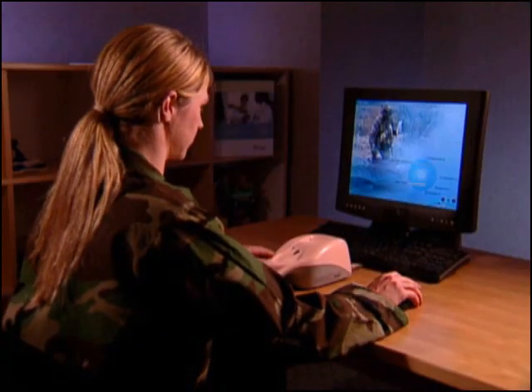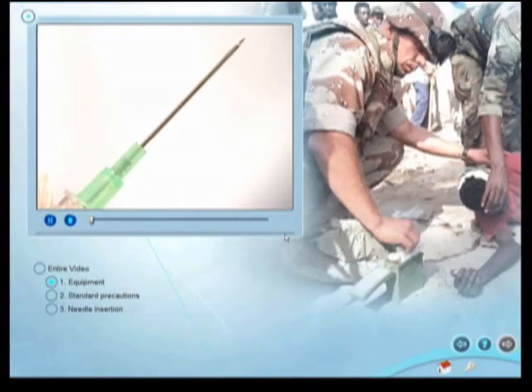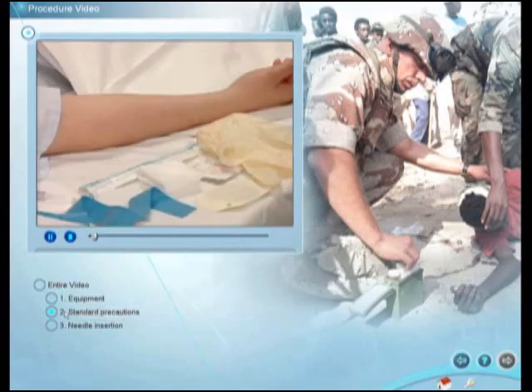If you are unfamiliar with intravenous catheterization, or if you desire to review correct catheterization technique, select Procedure Video from the main menu. View the educational catheterization video in its entirety, or select chapters to focus on specific problem areas.